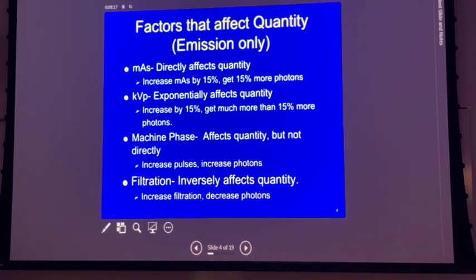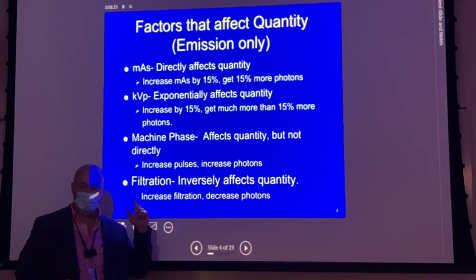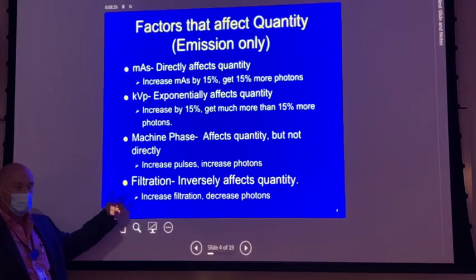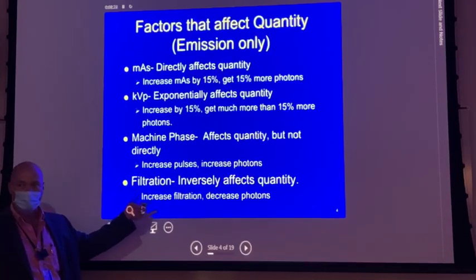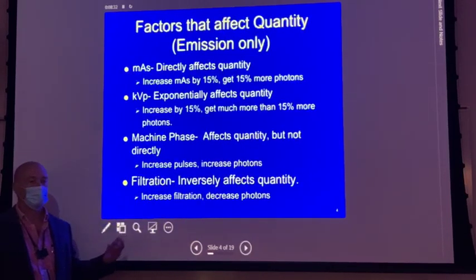So filtration. What is the purpose for filtration? Remember. William Rollins invented filtration to remove low energy X-ray photons. And what did that help with?